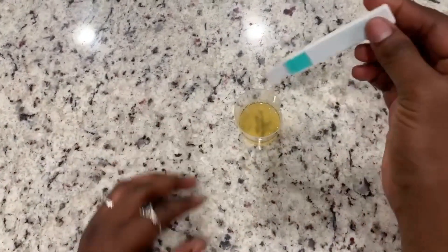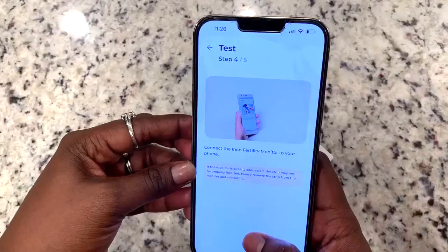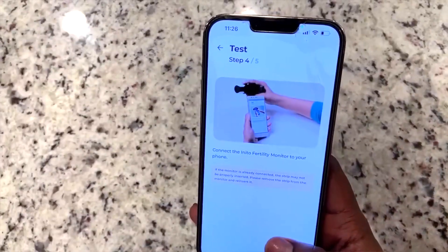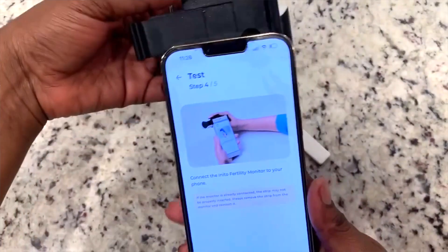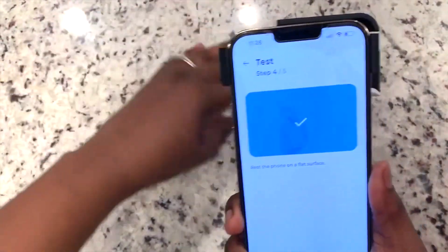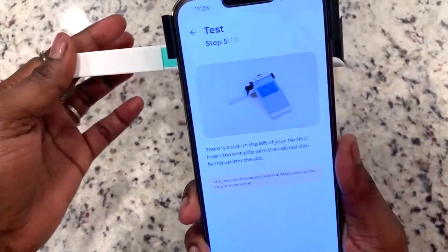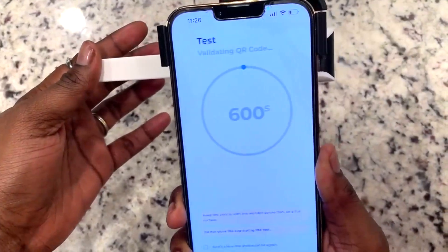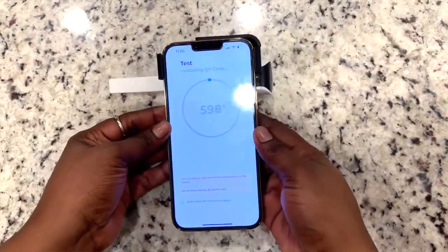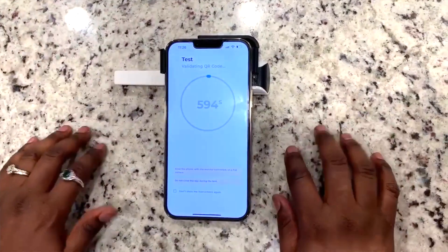In order to use your fertility monitor, you collect urine into the cup, then dip the test strip in the urine for 15 seconds. Attach the monitor to your phone, insert the test strip into the monitor, and watch the magic happen. After it has collected all your information, you will get your personalized results from the app on your phone.